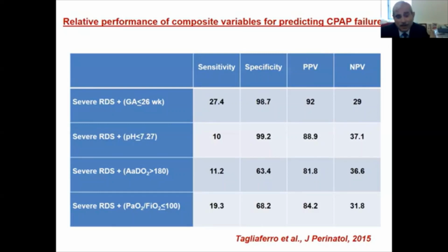And as you get better with your implementation of binasal prongs, we all know now, if you look at the algorithm for resuscitation or targeting oxygen, even the NRP is saying, at 1 minute, oxygen saturation should be in this range, at 2 minutes, it should be slightly over. We know in utero saturation is about 67%. The next number any caretaker wants to see is 100, without forgetting that there are numbers between 67 and 100. And I personally believe when you do that with the use of CPAP, you're expanding the lung more physiologically, causing less barotrauma.